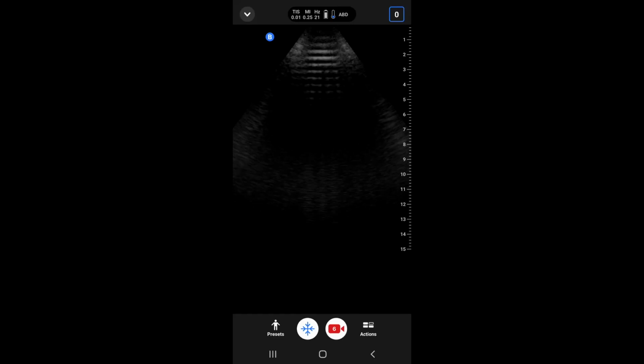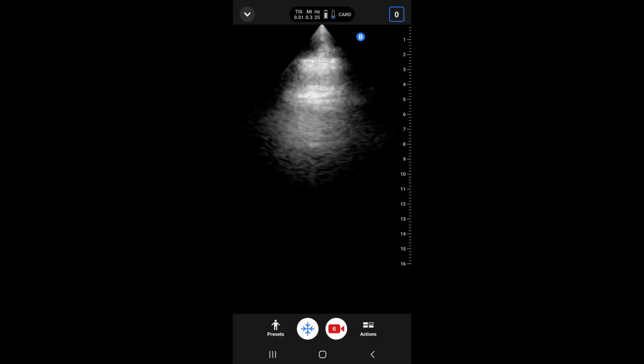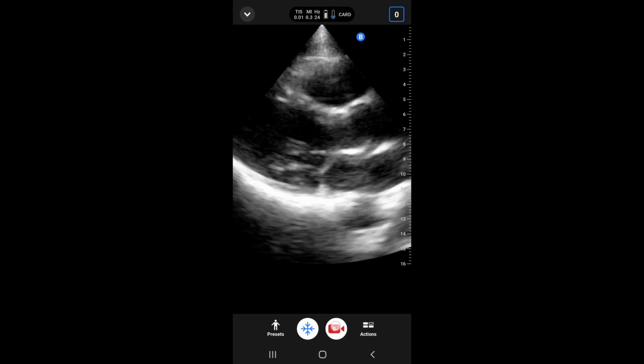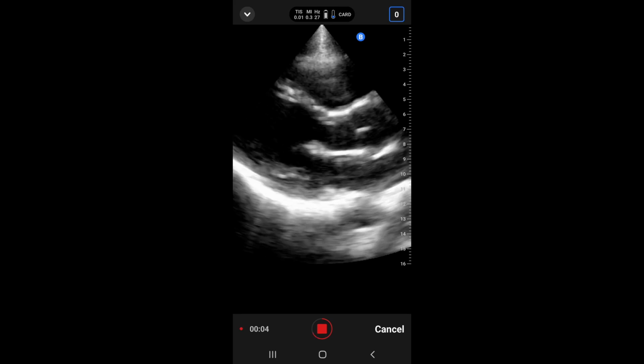When you're ready to scan, select your preset with the button on the bottom left. And then you're good to go. When you see something you like, tap the camera button, and you'll see a little timer countdown and record everything on the screen for the next 6 seconds.